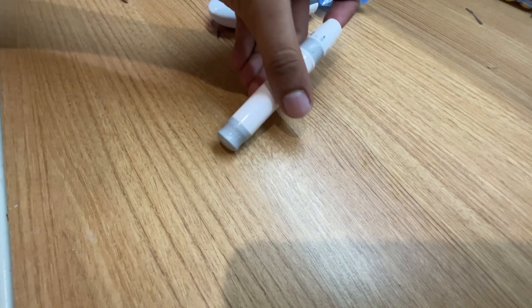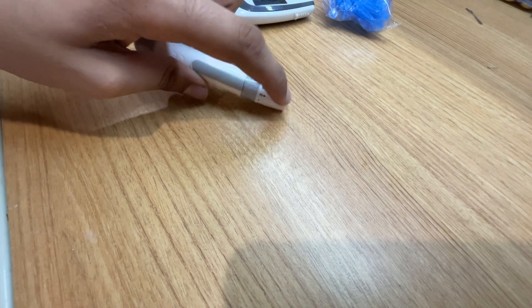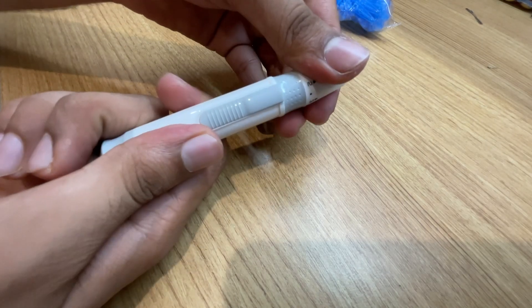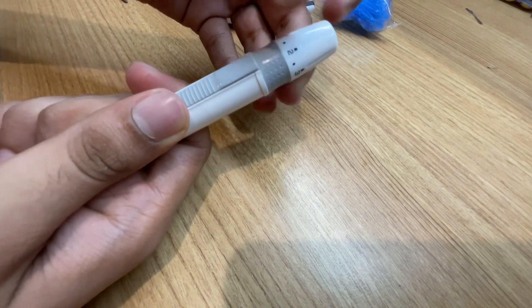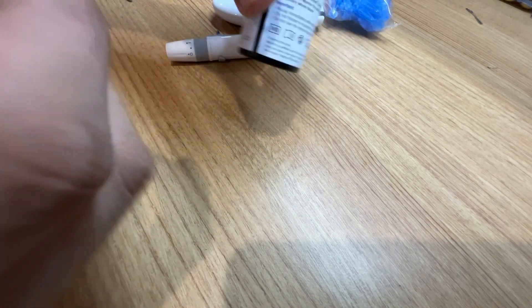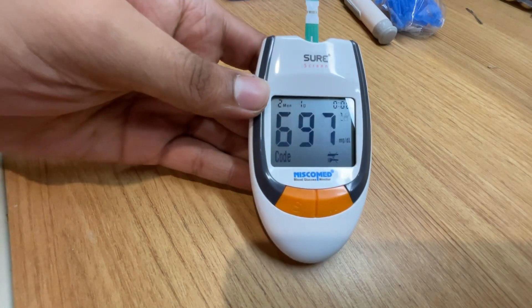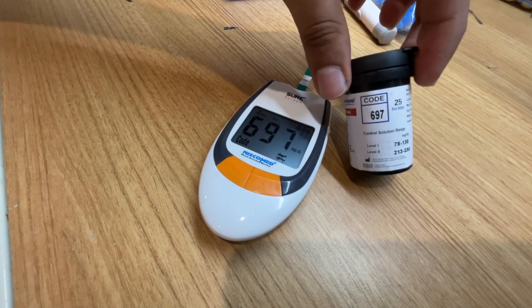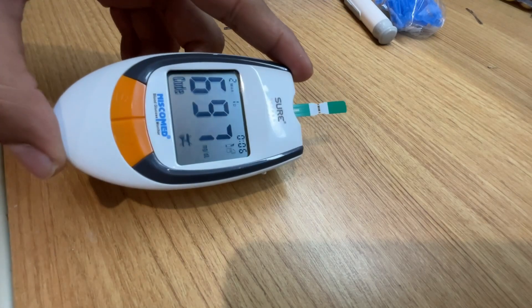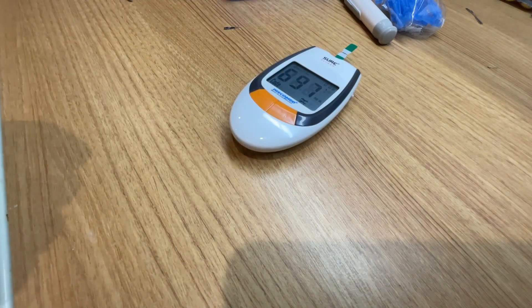To use the lancet device, you load the lancet into it — there is a clicking sound when loaded — and then you eject it. Then you insert the test strip into the strip slot. As soon as you insert it, the device shows the code 697, which matches the code on the strip. Once that matches, the device is ready to use. I'll now show how to properly take blood from your finger and use it to calculate your sugar level.